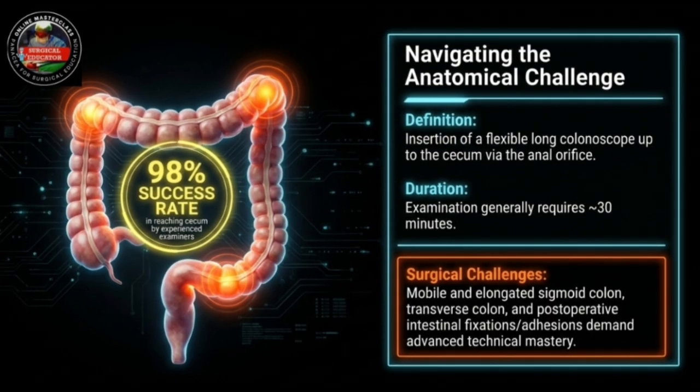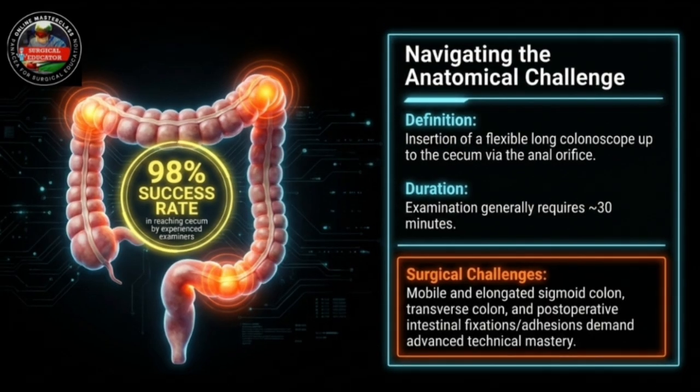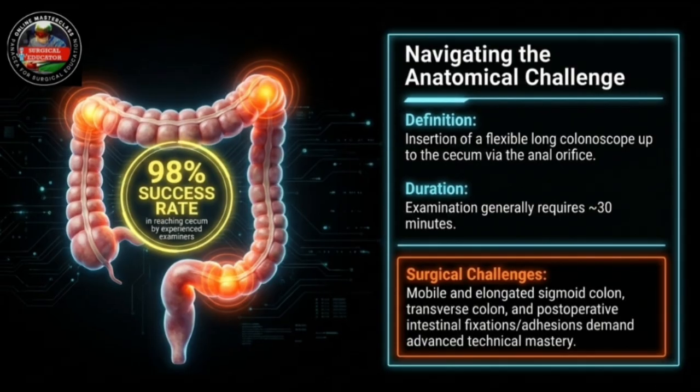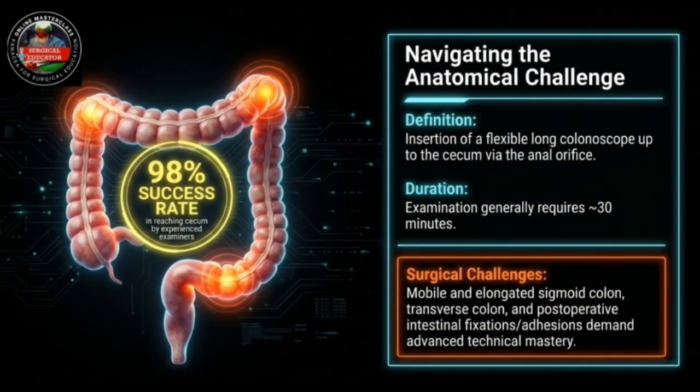Man, that's intense. But none of that careful navigation even matters if the camera lens is staring at a wall of debris. No, it doesn't. If we're going to navigate that dark, twisting anatomy safely, we need maximum visibility. And that necessity brings us to the cleansing mandate detailed on slide 4. The dreaded prep. Yeah, exactly.